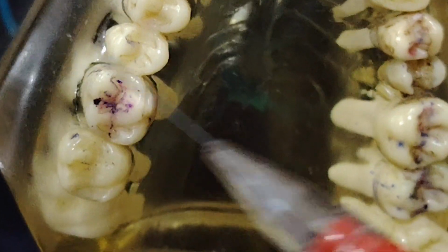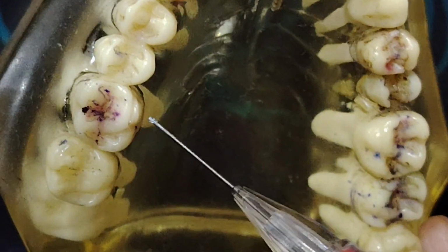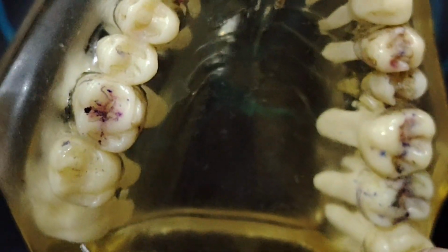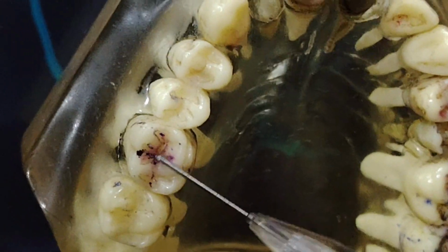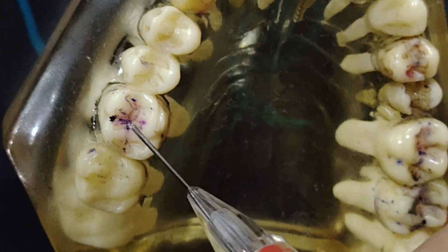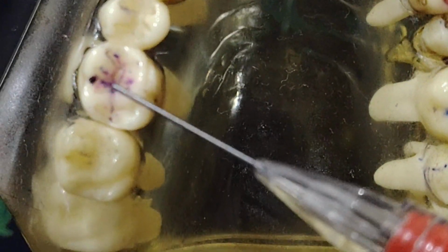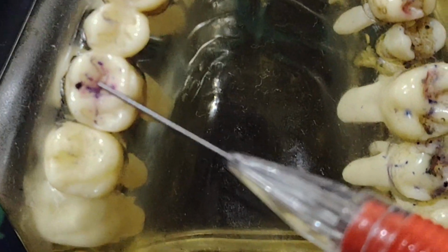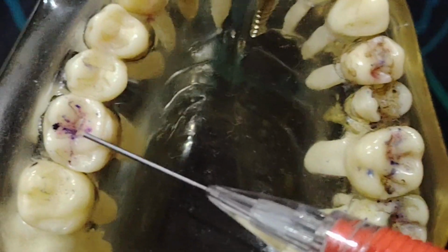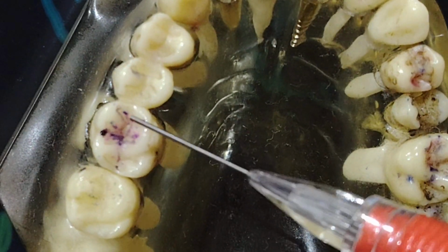That's the oblique ridge, which we will not touch. First we will make a small ditch here in the central fossa. We'll make one ditch here. After making a small ditch, we'll go palatally, here.